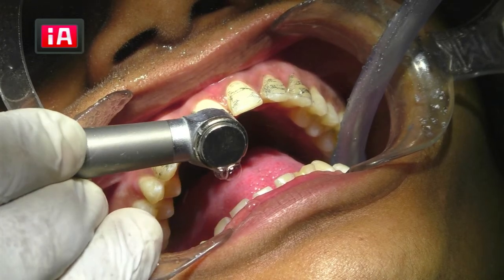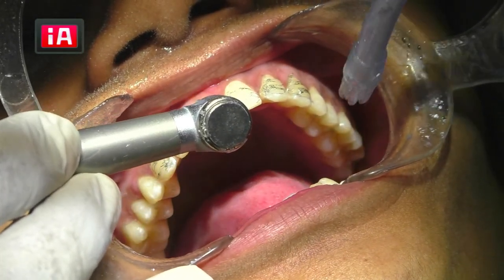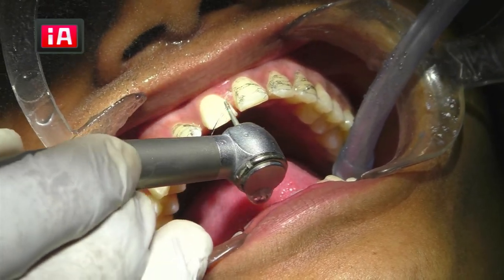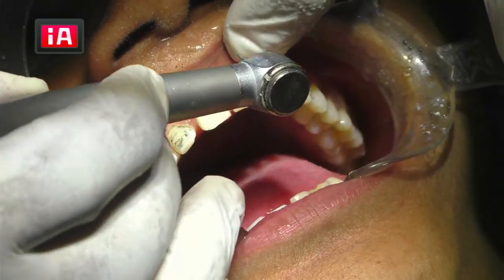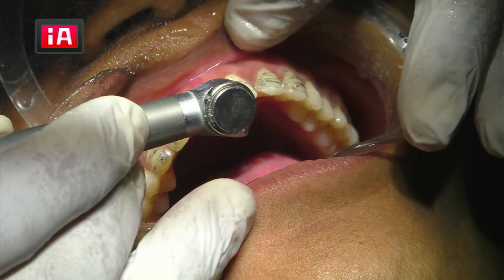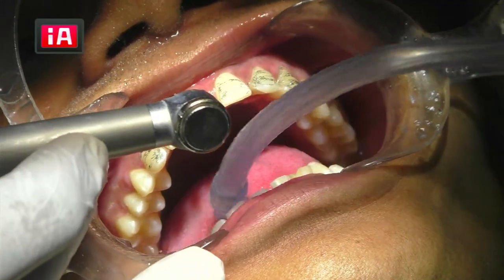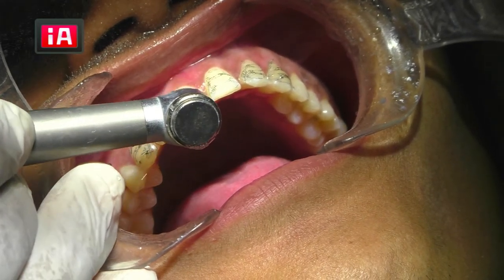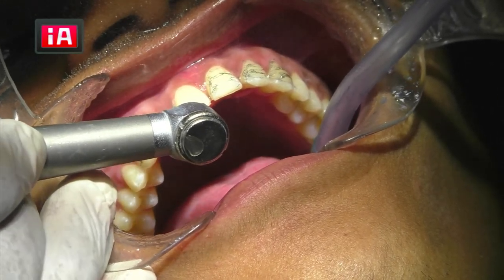Now from here I'll pass to the proximal side. Can you see that? I'm going towards the proximal side, at the central incisor. First I'll join these grooves together, then I will start with the margin. I'll make the margin equigingival. Keep your burr exactly parallel to the long axis of the tooth so that you get the required taper. There should not be any undercut.